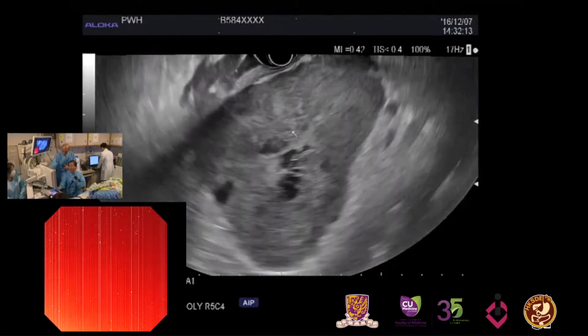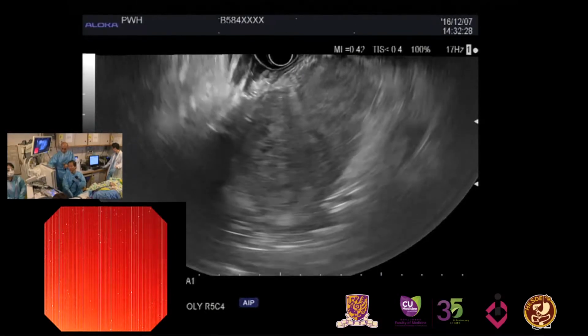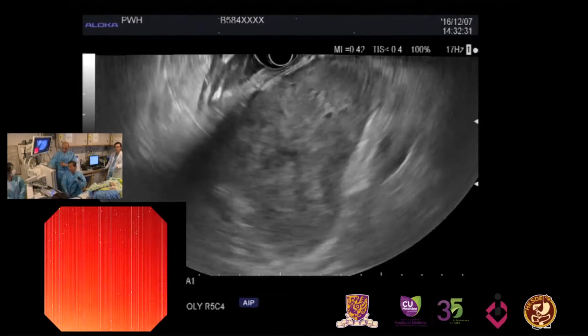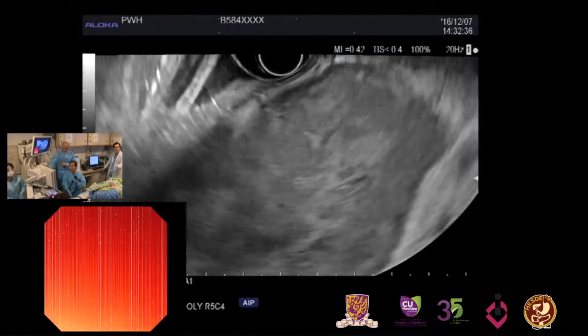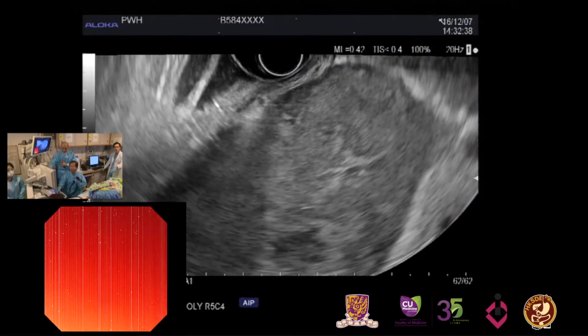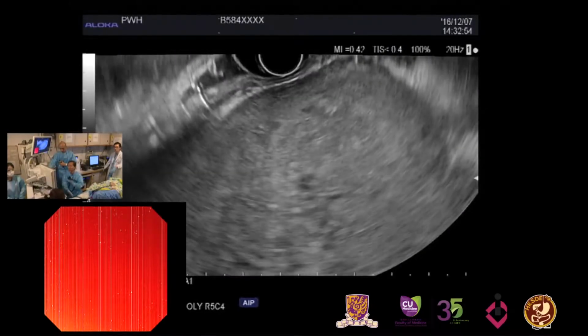This is a very large lesion. For this lesion, we need to adjust the penetration. If we measure the dimension, from here to here is probably more than 11 cm. So a very large cystic, huge mass. If you see just this plane, it looks like it is located outside of the stomach. This is the gastric wall, and this side is also gastric wall. But the main region is located outside of the gastric wall, so it may look like a pancreatic or retroperitoneal lesion.